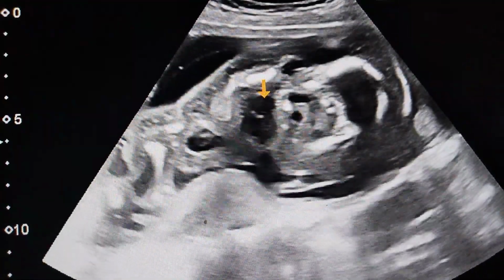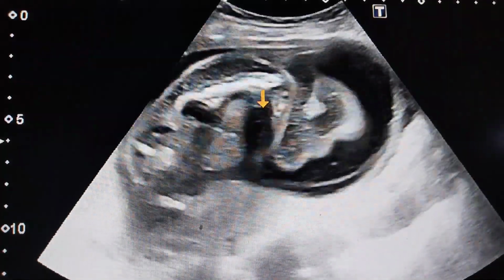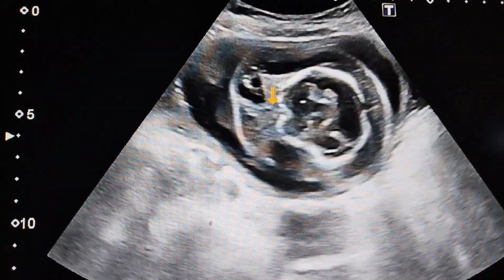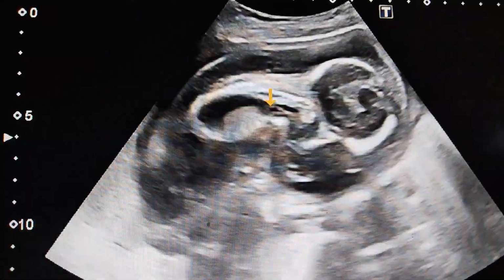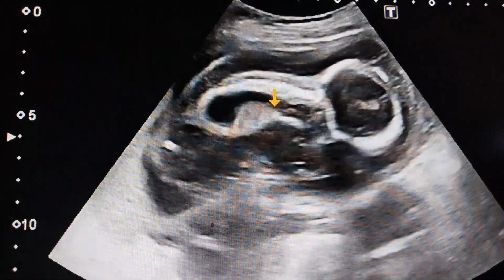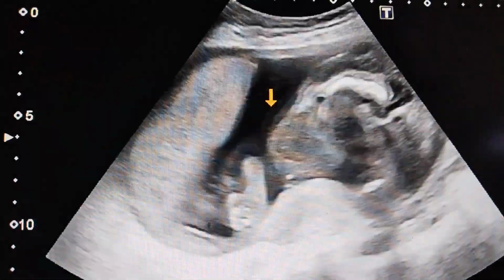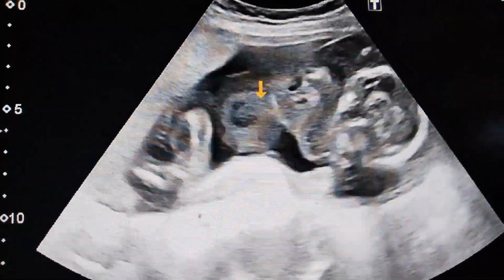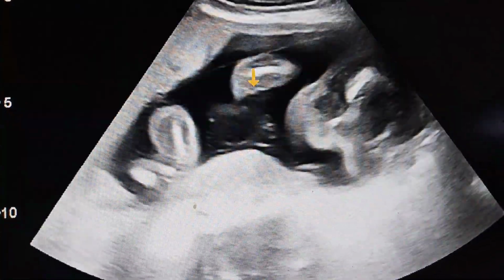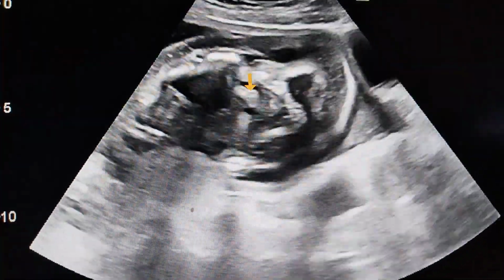When non-immune Hydrops fetalis is present, we should also look for any fetal cause, because non-immune Hydrops fetalis is usually due to a fetal cause, while immune Hydrops fetalis is due to a maternal cause, in which the maternal blood group is negative and the fetal blood group is positive, and the antibodies present in the maternal blood cross the placenta, and then they attack the antigen of the fetal RBCs, and then hemolysis occurs, and due to hemolysis severe anemia occurs, and then there is Hydrops fetalis, with effusion and skin edema, subcutaneous edema.